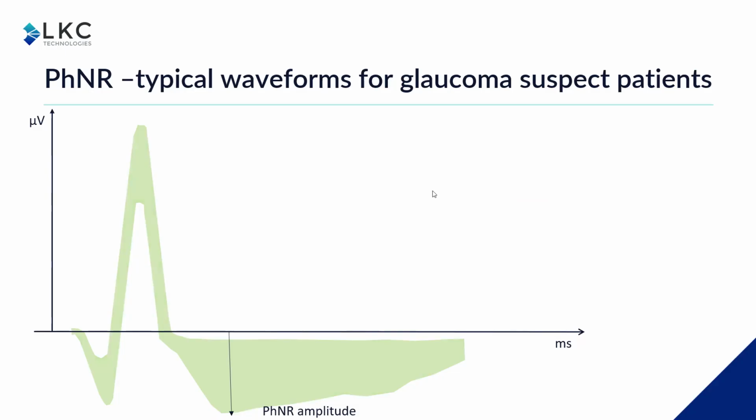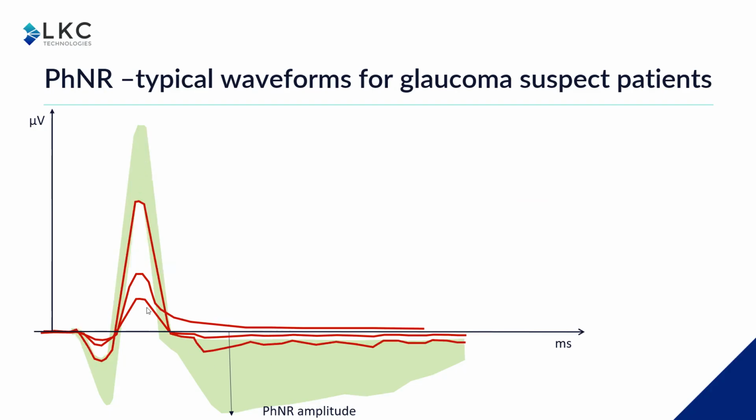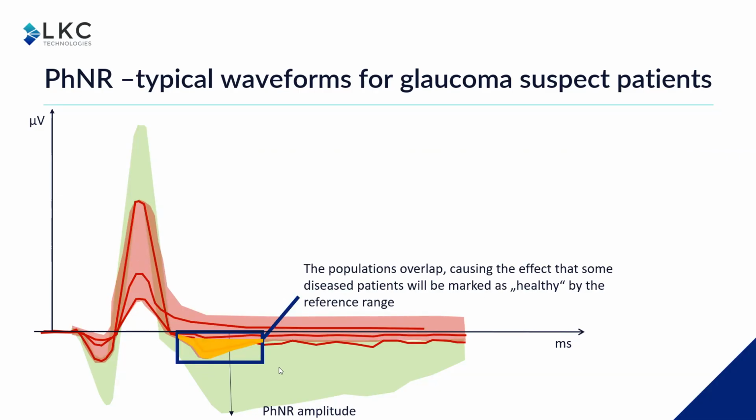During the time when we collected more and more data from clinical studies and got feedback from the users, we realized that if we look at healthy versus diseased, there is a group that can have a green color from the reference data for healthy subjects, but can be diseased. To address this overlap in the population, we decided to improve our algorithm and turn the attention of the doctor from the colored reference data to the clinical decision limits.